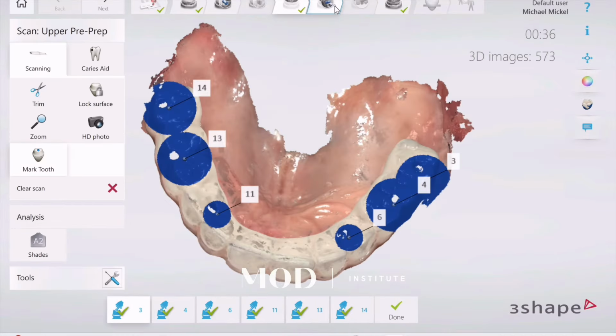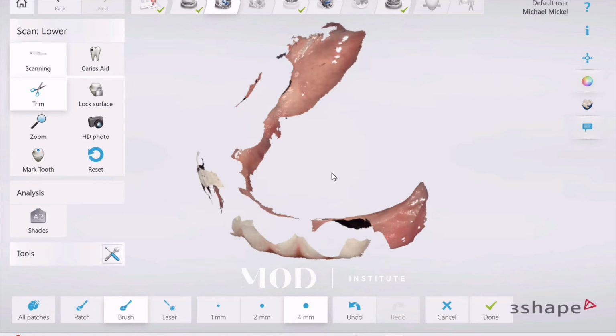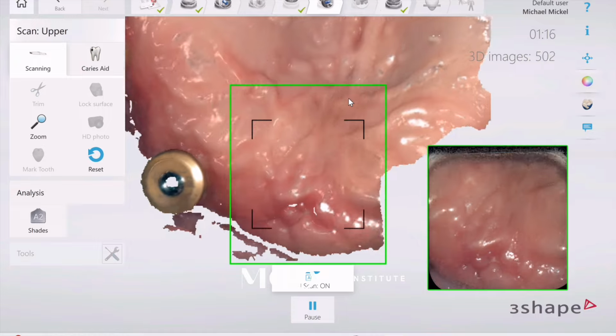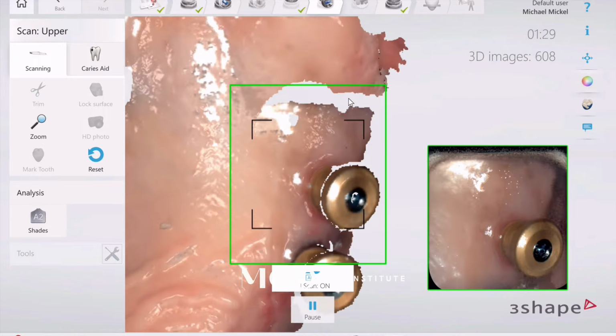If you now proceed on with the workflow, you then need to duplicate those scans, which happens automatically in 3Shape, and then delete the prosthesis, but keep all the tissue. You're then going to screw in TruAbutment scan caps. These are not scan bodies. These are just like healing caps. They have two different styles.